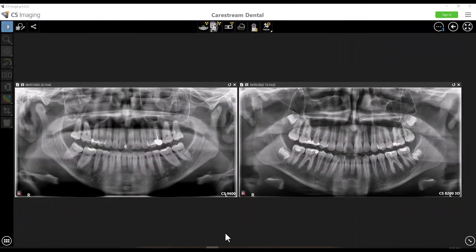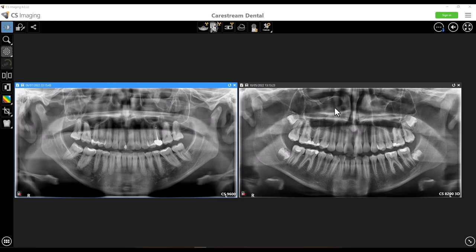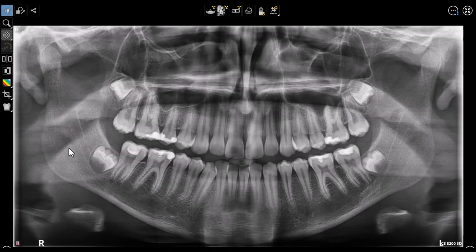We've got two examples here. One was taken on the CS9600 and the other on the CS8200 3D. You can see in both examples there are radiolucencies around the maxillary apices. That's air, and that air is caused by the tongue not being pressed along the roof of the mouth. You can see how it could impact what you're trying to diagnose.